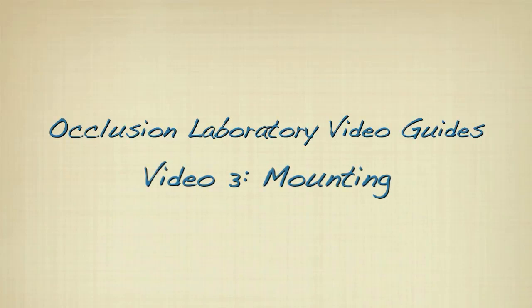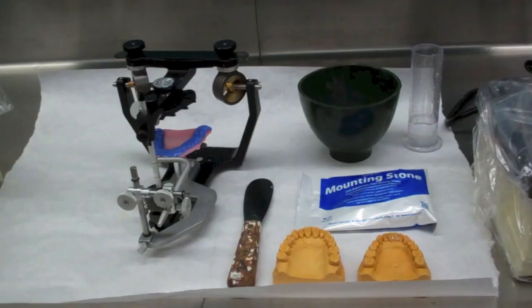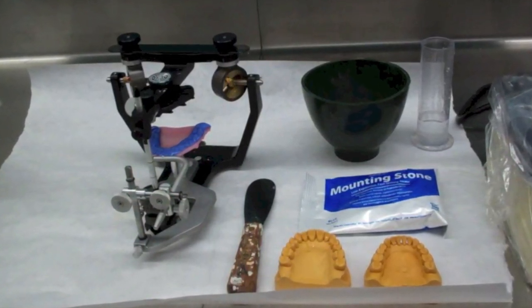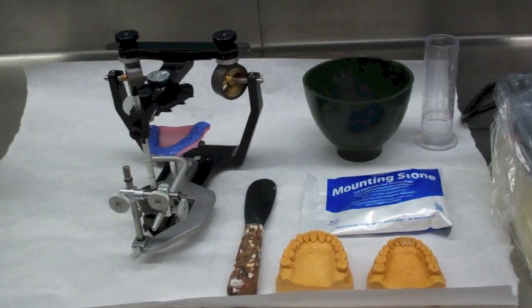Occlusion Laboratory Video Guides Video 3: Mounting. For this exercise, you will need your facebow transfer, articulator, rubber bowl and spatula, and mounting stone.